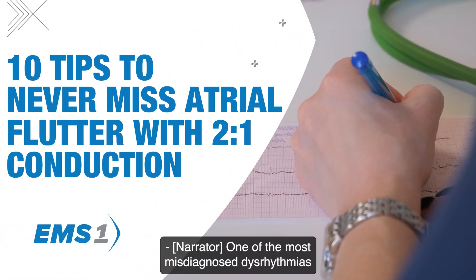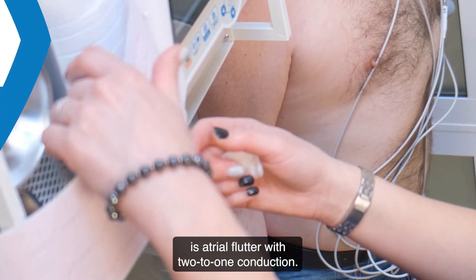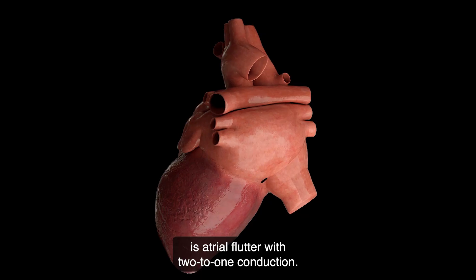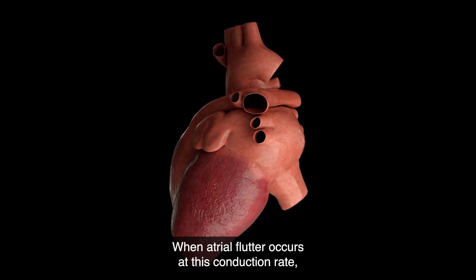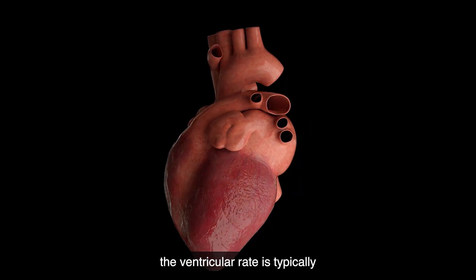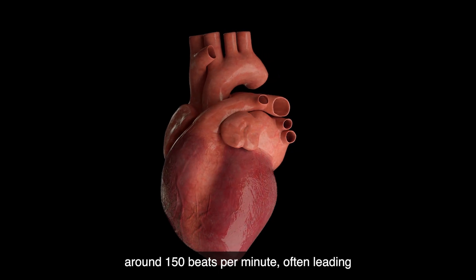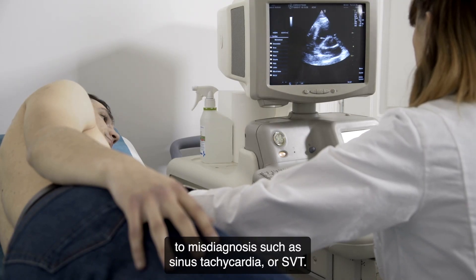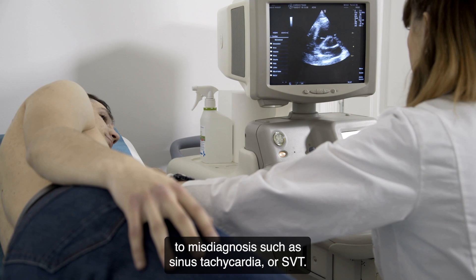One of the most misdiagnosed dysrhythmias is atrial flutter with 2-to-1 conduction. When atrial flutter occurs at this conduction rate, the ventricular rate is typically around 150 beats per minute, often leading to misdiagnosis such as sinus tachycardia or SVT.